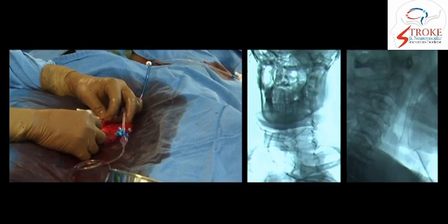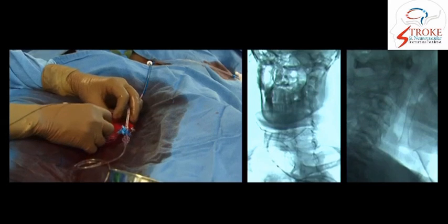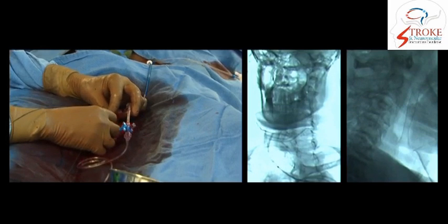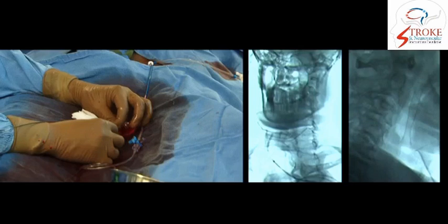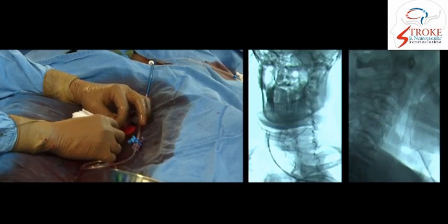At all times care is being taken to keep the filter wire very stable. After some gentle manipulation, the stent passes through.